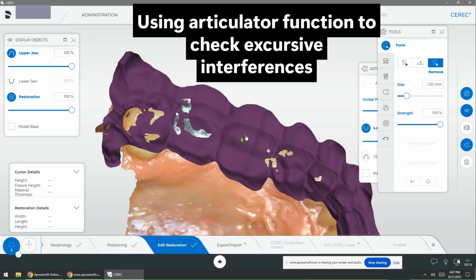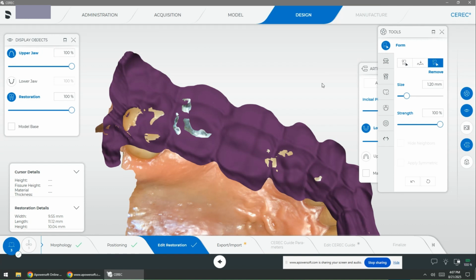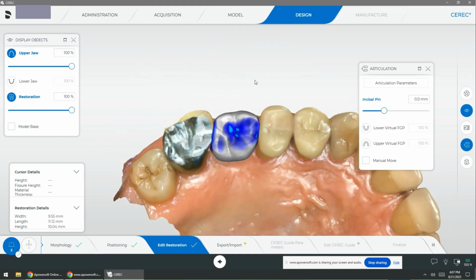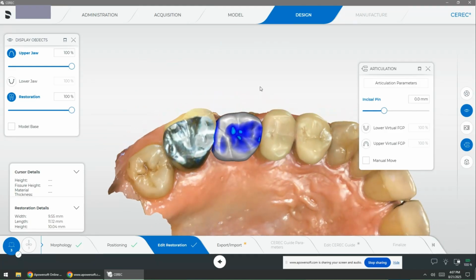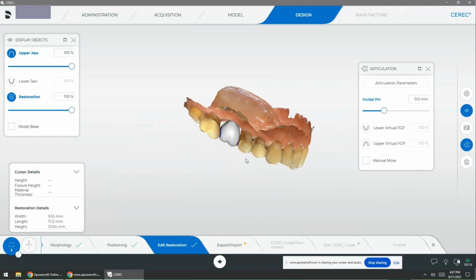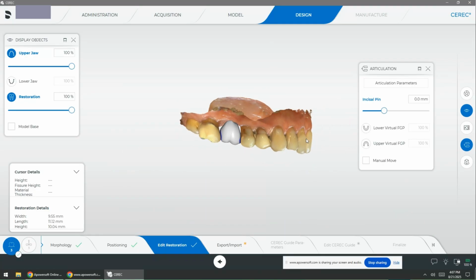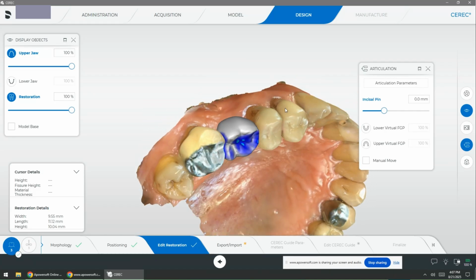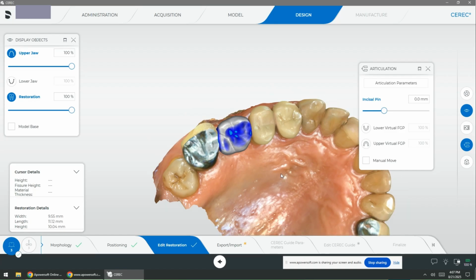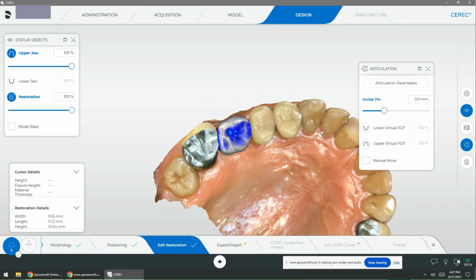You don't want to make the reliance on the lab. The lab are not clinicians. They're lab techs. They'll give you their opinion, but their opinion has no value. The only value is you approving it. If you approve it and it's wrong, then it falls on you. So take time, understand the implant planning process. It's not a check mark. It's not a checkbox. In your practice, it's going to be what you sign off on. Okay? So let's go through this case.